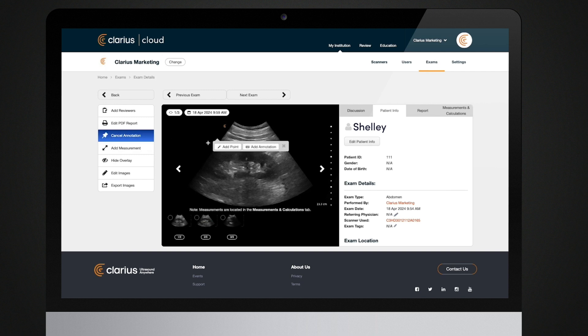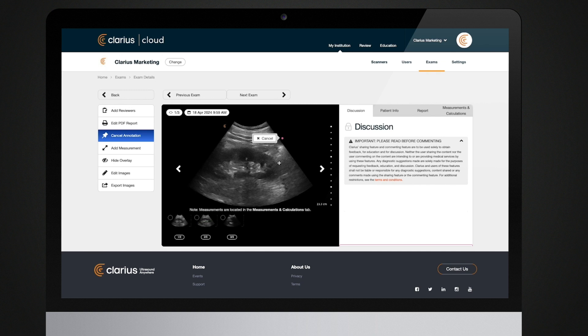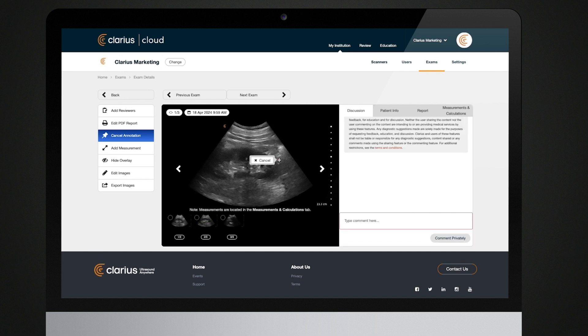You can also add longer comments by clicking Add Point. These will be displayed on the image as a point and will reference a comment in the discussion section.